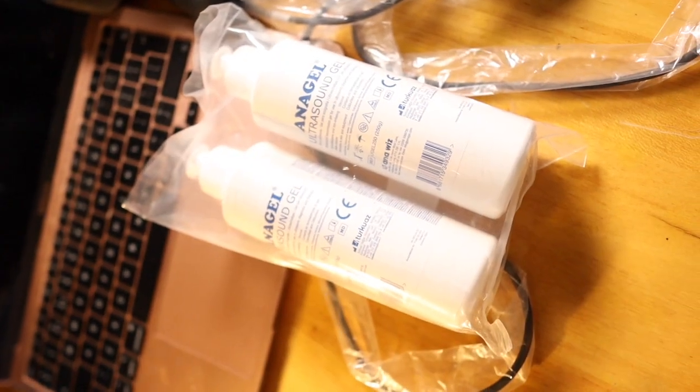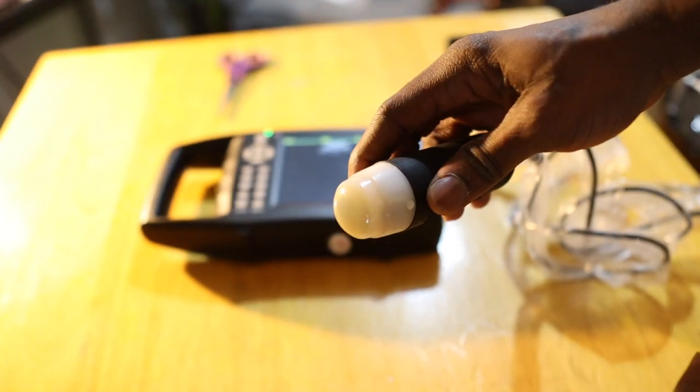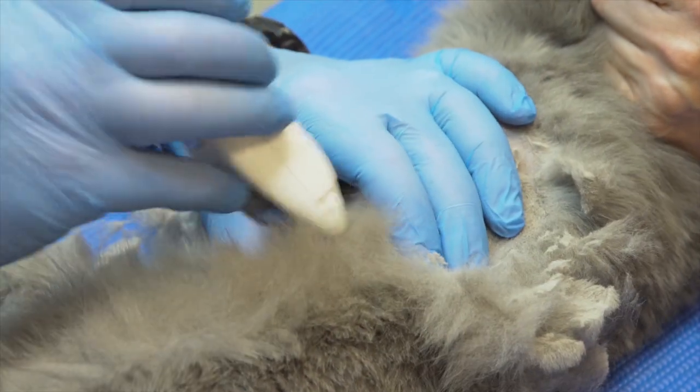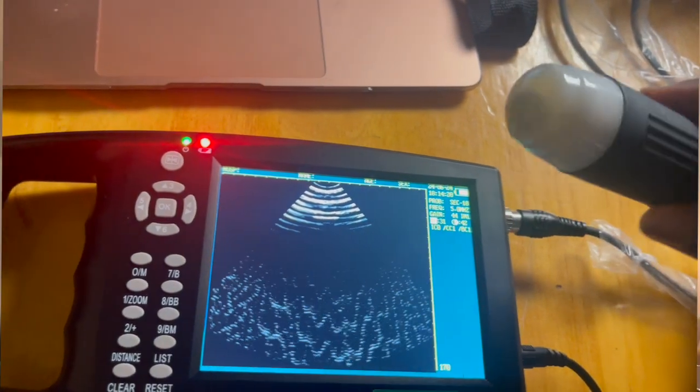When you are ready for scanning, apply an amount of medical ultrasound gel to the diagnosis area of the animal's skin, then press the acoustical window of the probe closely to where you applied the gel. The area to be scanned is typically shaved or cleaned properly to ensure good contact between the probe and the skin. You then move the probe to locate the optimum position. For pregnancy detection, this device allows you to confirm pregnancies early, usually within 25 to 30 days after crossing your pigs, which is very important for managing your pregnant sows and planning for farrowing.